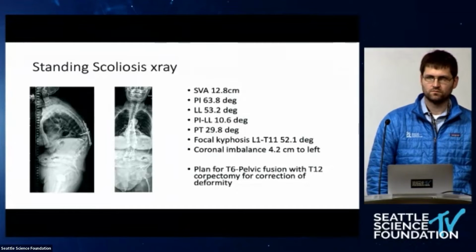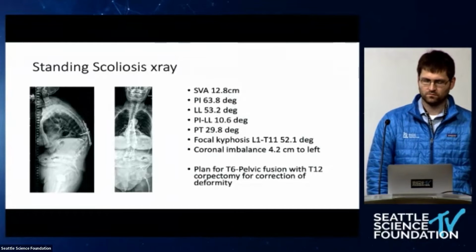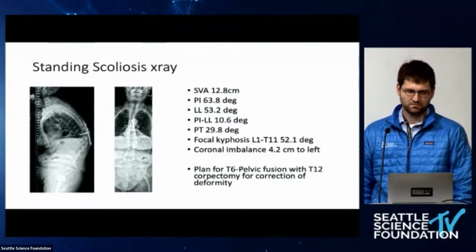So a year out, she's totally healed, and he was a little hesitant to pursue any surgery. I don't know why in the world he left the rest of that hardware in there. If you're going to take the distal part out, he didn't even expose it. I think he just cut the rod with a carbide bit because you could see metal scraps in the wound. His op note seems to indicate that he just opened that one part at the very bottom. And well, he obviously wasn't real committed to it.